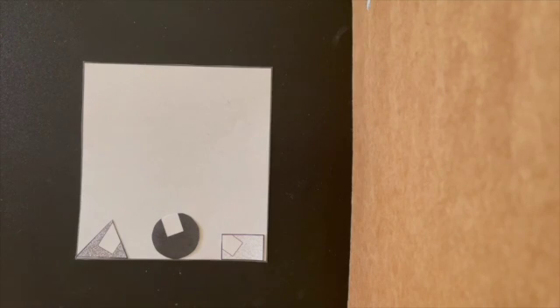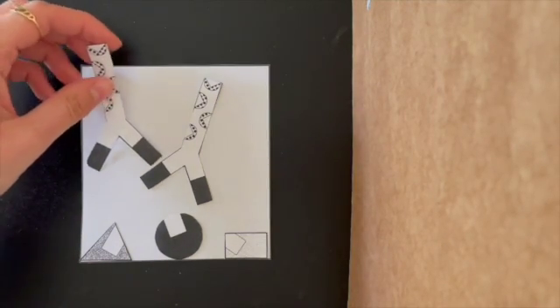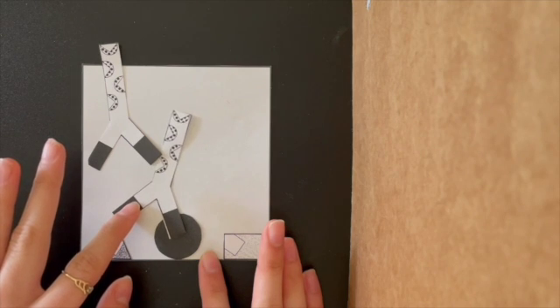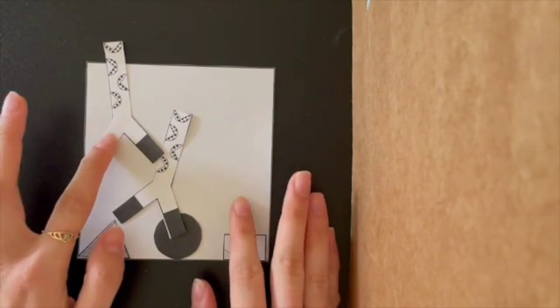The model follows a similar process to studying a patient's sample, where it is necessary to add the antigens to the designated well. Then the primary antibodies are added to the well, where the antibody interacts and binds to the SARS-CoV-2 virus. The control follows the same steps of incubating for 5 minutes and adding a wash buffer.